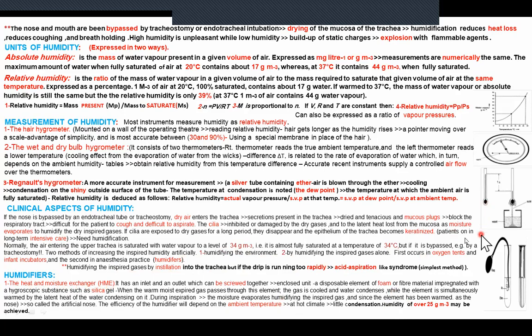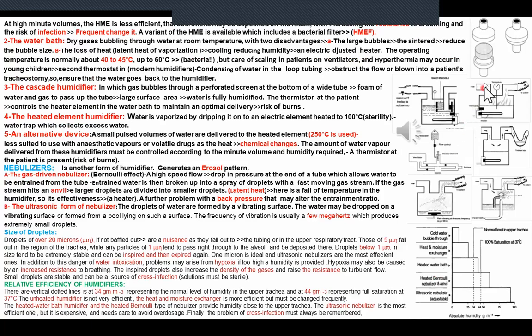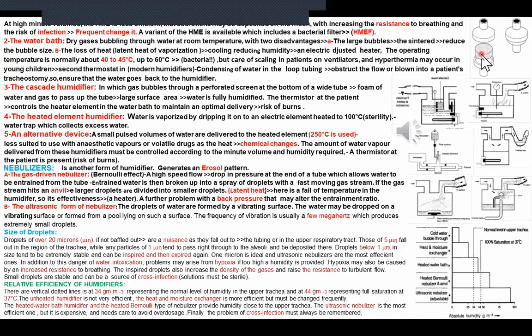It's made of two screwed plastic parts, which we screw to each other. In it we have a fiber element, or a mesh, and a hygroscopic substance such as silica to absorb water.